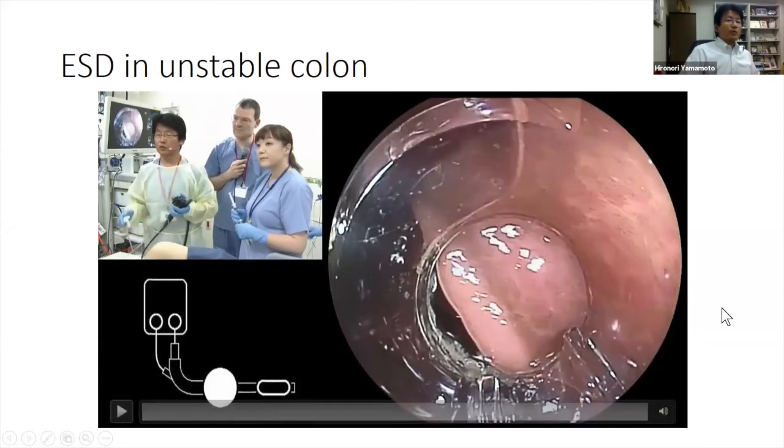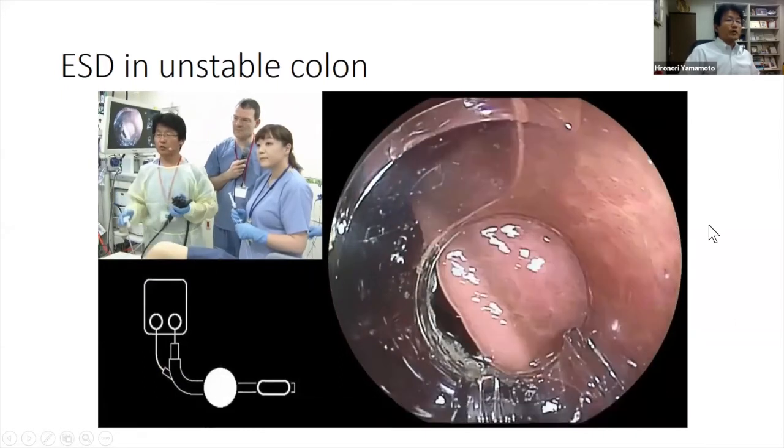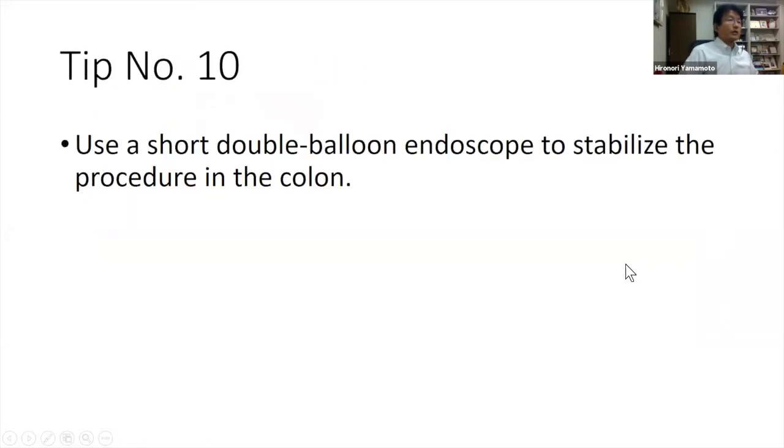So even with the double balloon endoscope, that endoscope control can be done just by myself. Use a short double balloon endoscope to stabilize the procedure in the colon.